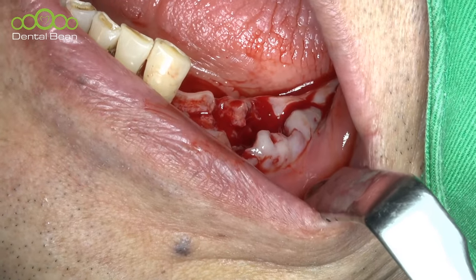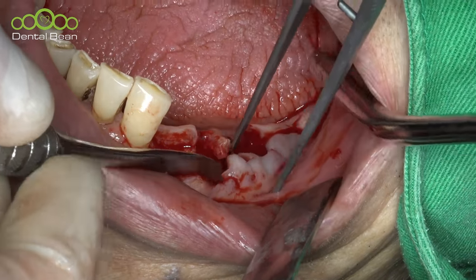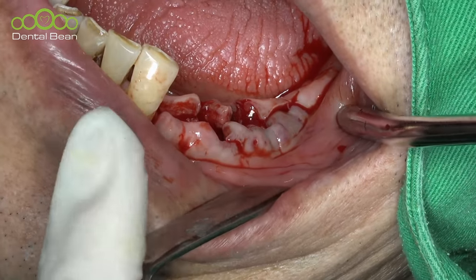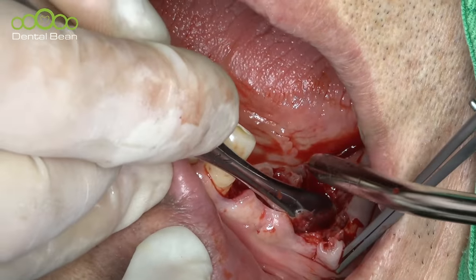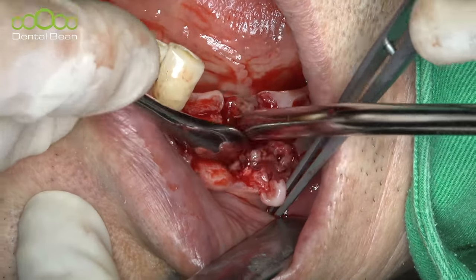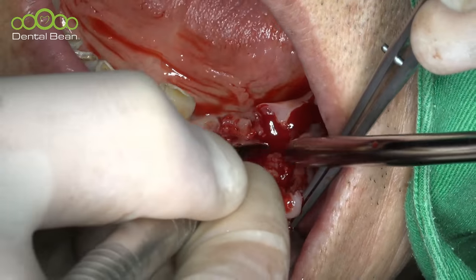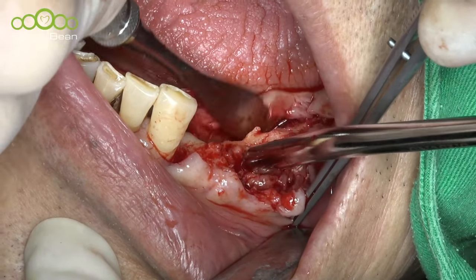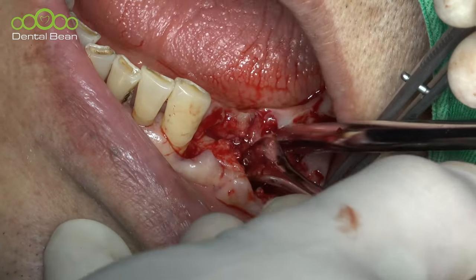Holding, please. At this time, usually severe inflammation area, flap elevation is sometimes very difficult. So at the time, holding here, tissue forceps, periosteal elevator. So with a slight elevation with the margin, and then using the here, so you have to expose the bone, full thickness flap, full. With this manner. And then lingual flap also, retraction. The full thickness here. And this is the granulation tissue. Usually I use the periosteal elevator.